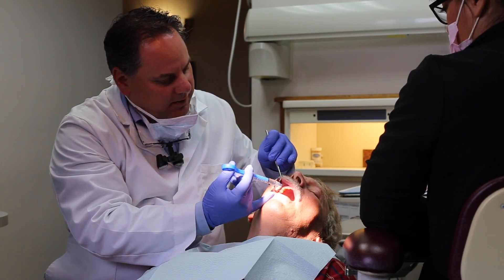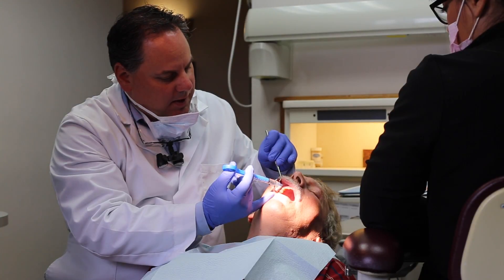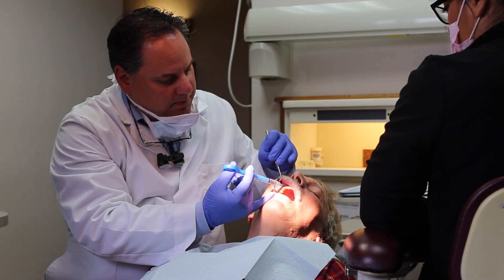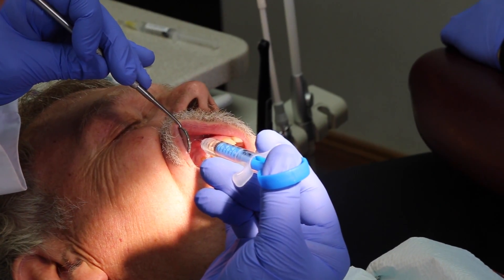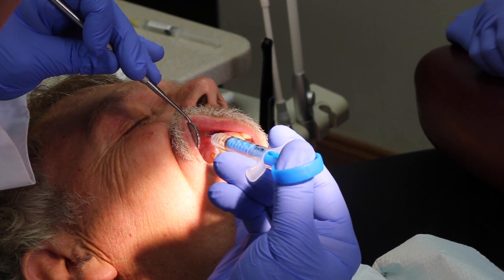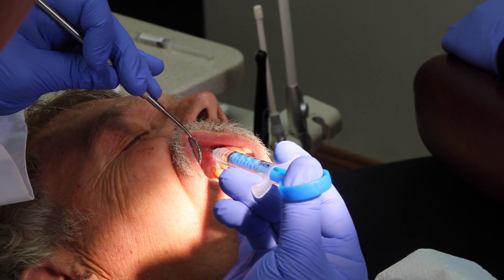One of the beautiful things about this is, as you're about to hear, there's a haptic sound coming from the syringe. So as I'm doing that drip, drip, drip, you'll hear a little click — there it is. And that allows me to know that I am indeed delivering the medicine to the tissue.